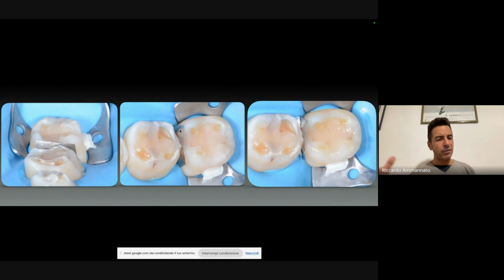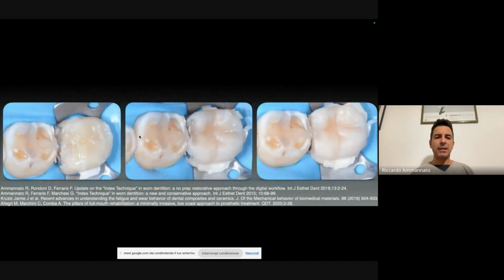It's okay also the Teflon tape. I use also that. It's not so easy to place it in between two molars that have the contact points. However, here I'm doing my adhesion, and then I will use my heated up composite, and then I will cure, I will land with my index.